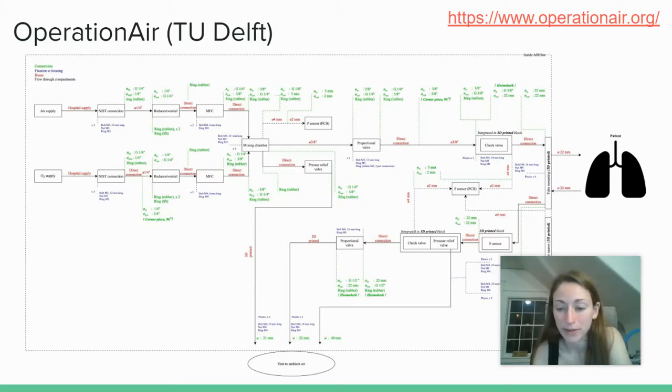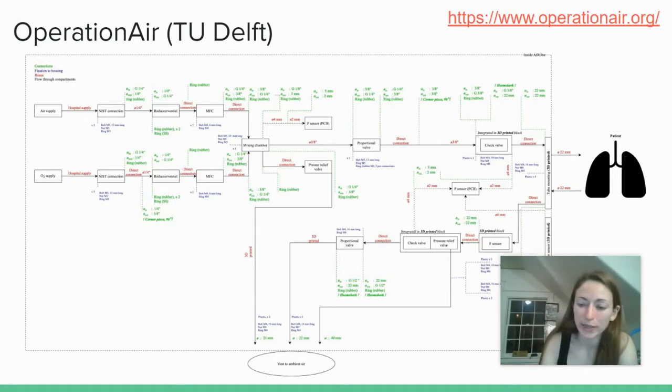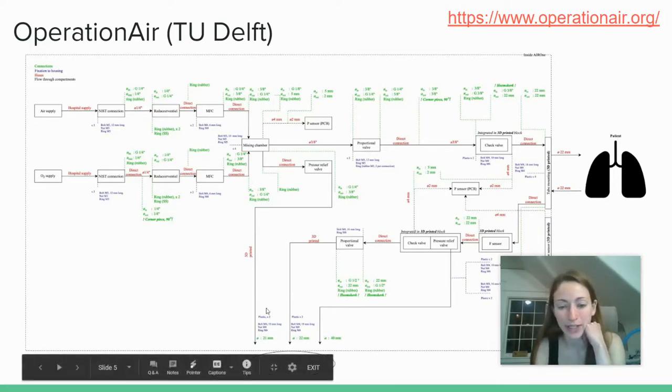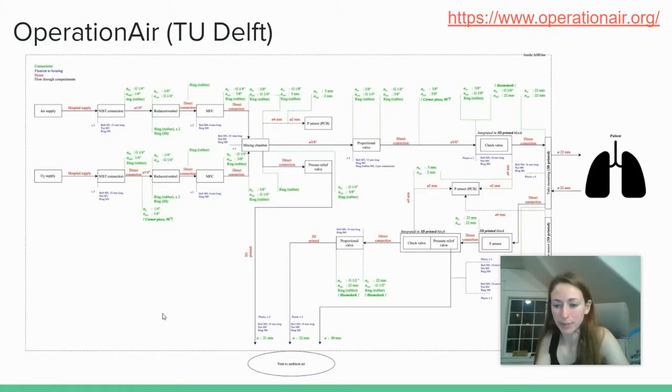If you'll recall from my video on speccing flow control components, we understand that the proportional valve that's spec'd for very high airflow and very low pressure is going to be way more expensive than something that works on the high pressure side with high airflow. So just from looking at the types of components that they're speccing for their device, we understand sort of what their project goals are. This isn't a super low cost device, but it probably is a rapid deploy device where they're trying to use as many off-the-shelf parts as possible. They're not relying on existing medical components like the gas blender. They're not relying on PEEP valves, so they're using this low pressure side proportional valve in lieu of that. And we can get the sense for what they're trying to produce as a result of these components.